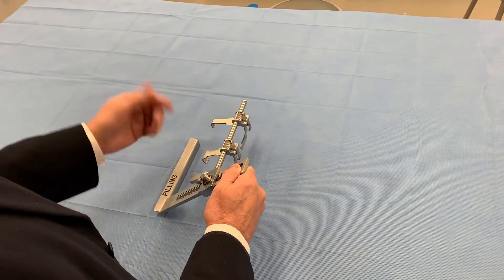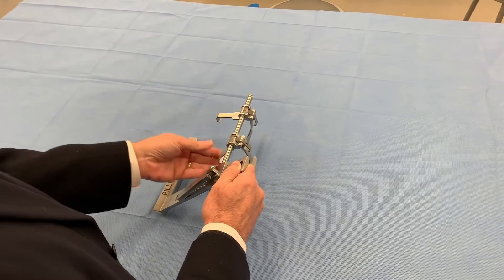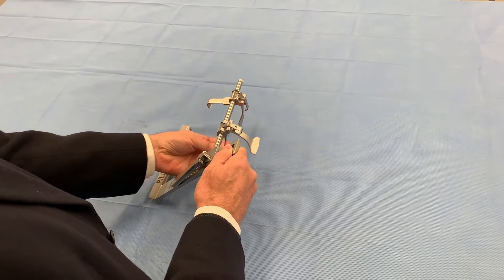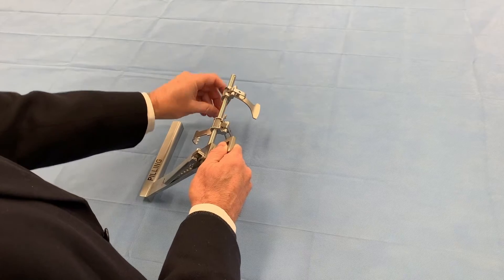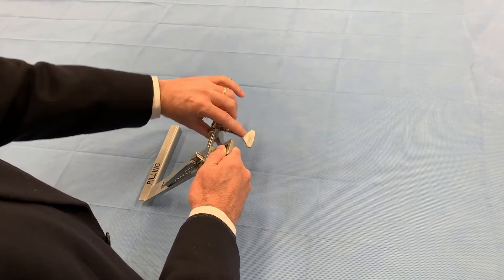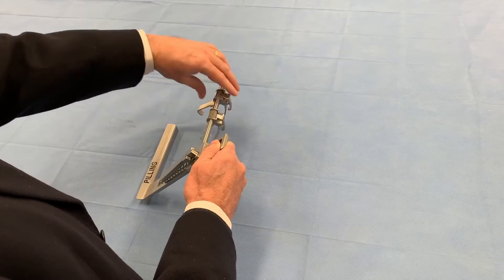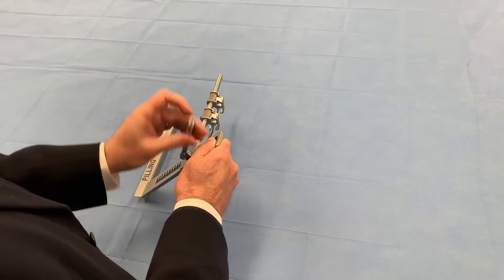In the normal position, you'd have the crank on the outside lifting up, the wide blade with the teeth is on the inside towards the rack, and the smaller blade with the teeth is up towards the head. You press to get a grip onto the chest wall — that's the LIMA side.